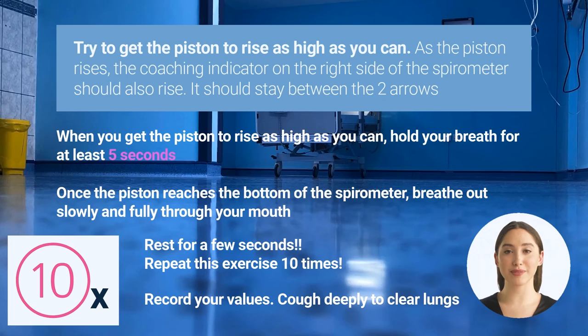Once the piston reaches the bottom of the spirometer, breathe out slowly and fully through your mouth. Rest for a few seconds. Repeat this exercise at least 10 times. Try to get the piston to the same level with each breath. Record your values — writing down the highest number the piston reached can help you change your goals and track your progress over time.